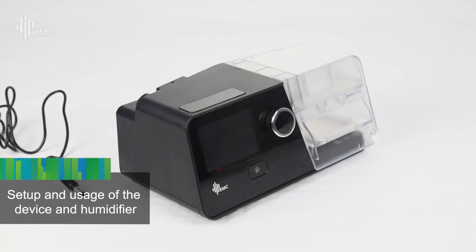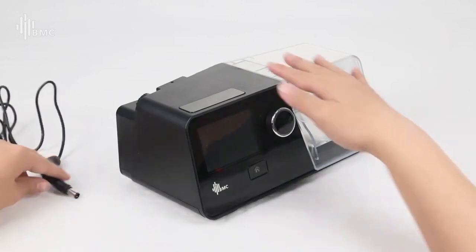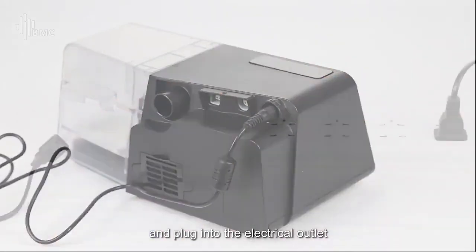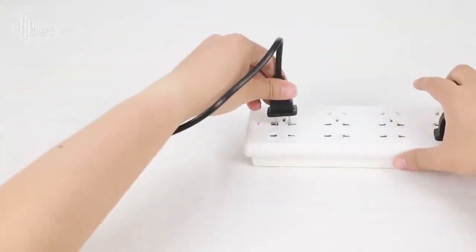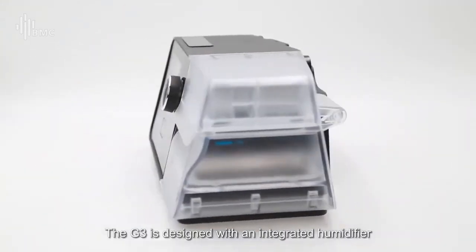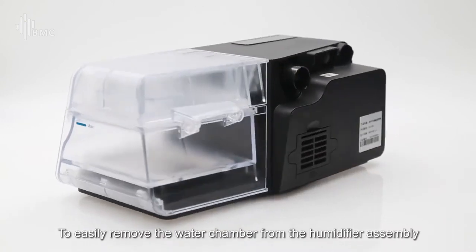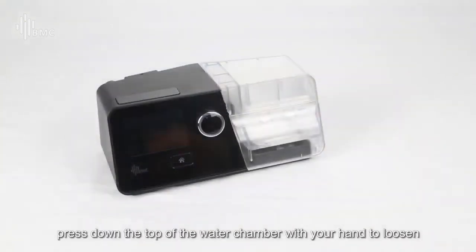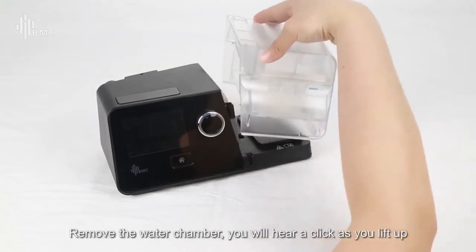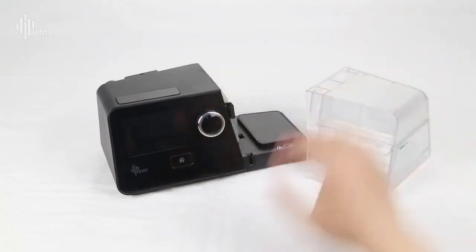Setup and usage of the device and humidifier. Connect the power cord to the back of the G3 and plug into the electrical outlet. The G3 is designed with an integrated humidifier. To easily remove the water chamber from the humidifier assembly, press down the top of the water chamber with your hand to loosen. Remove the water chamber. You will hear a click as you lift up.